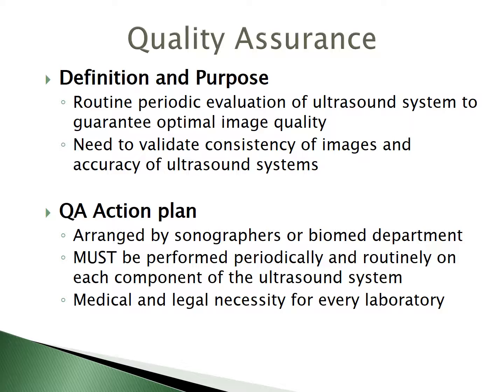Your action plan must be enacted periodically and routinely on each component of the ultrasound system. So not only are we checking the actual machine, but we need to check the probes, the cleaning devices, everything that goes into our studies. And this is going to be a medical and legal necessity for every laboratory. So if you have an ultrasound machine out there, it needs to be tested for quality assurance.